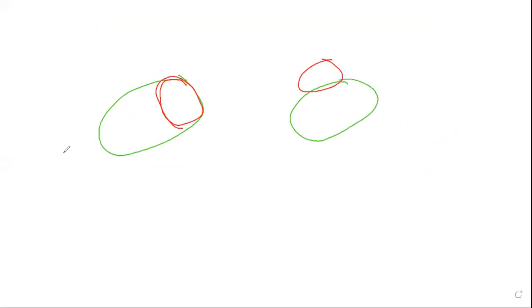Oh, pardon. There's some overlap here. It should not overlap. Just try and consider it. Oh, it's the eraser. Okay, it's easier this way. We'll draw it in. Now let's have it here. Okay, this is just adjacent. Okay, this is nice.